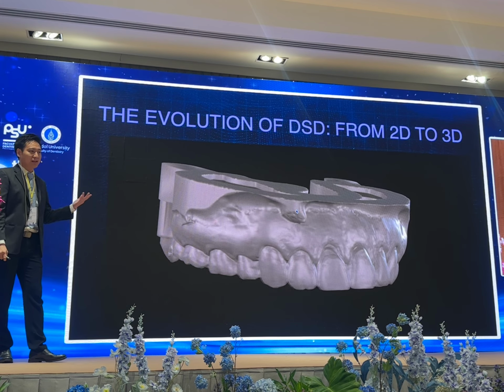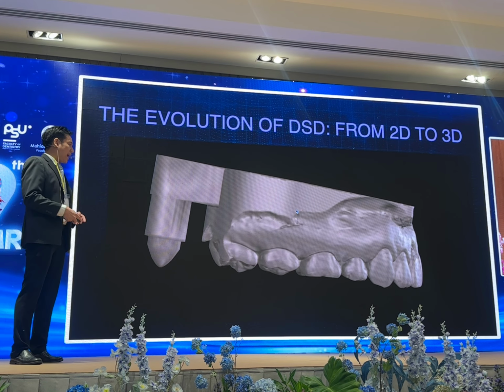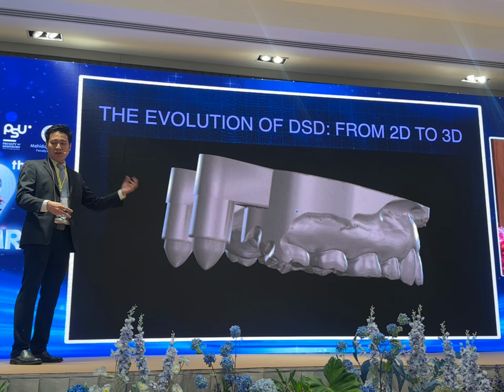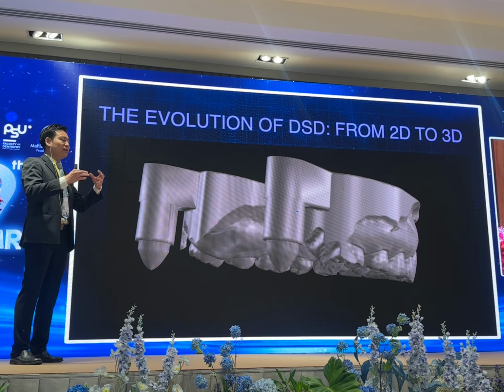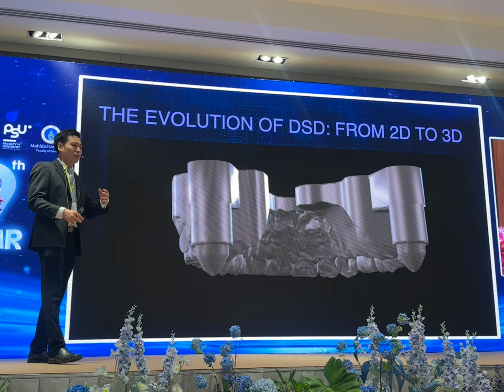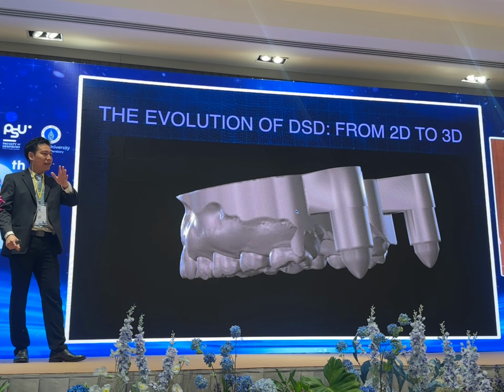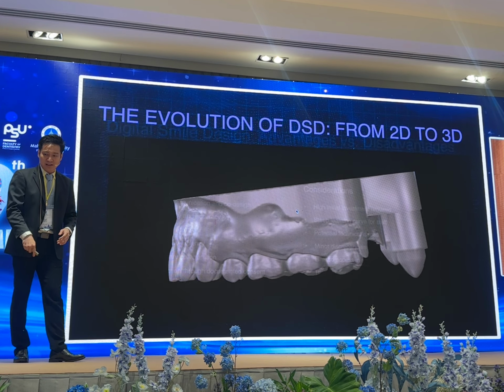And then you can export it. After you got your final design in the model, you can either use it the conventional way by 3D printing the model, and you go for the putty mock-up, go to the patient's mouth, or you can use this model to work later on for the digital processing.